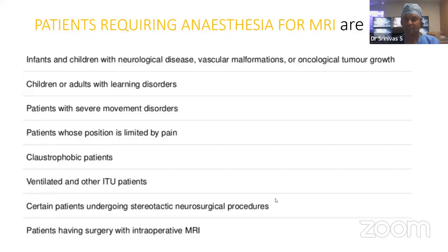These are children or adults with learning disorders, patients with severe movement disorders, patients whose position is limited by pain, claustrophobic patients, ventilated patients, neurosurgical patients, and patients having surgery with intraoperative MRI.